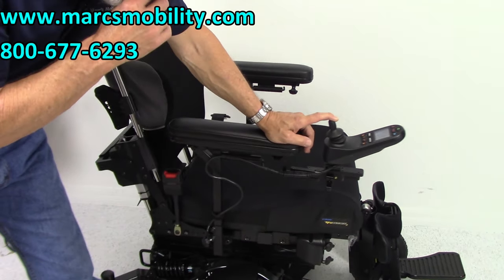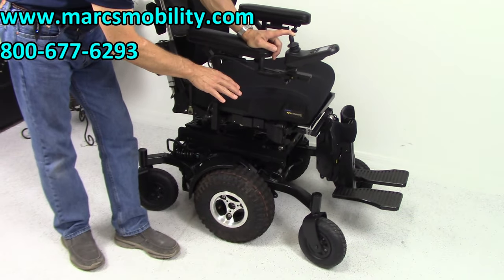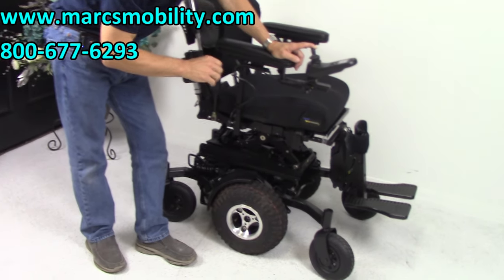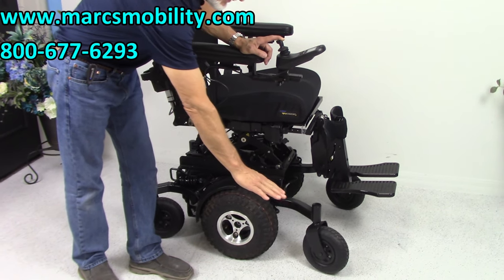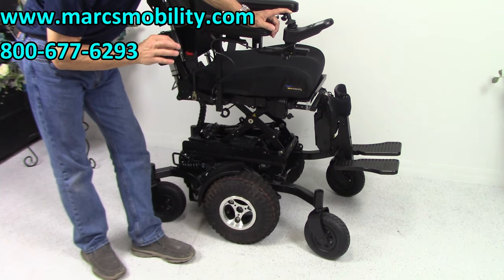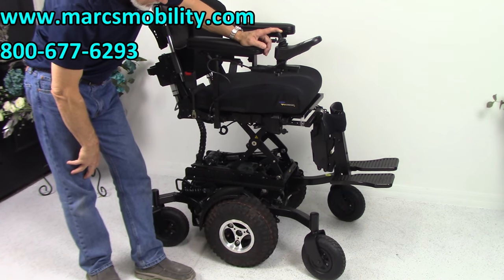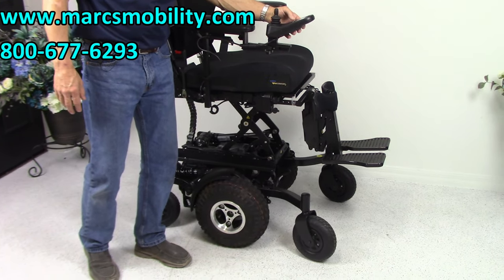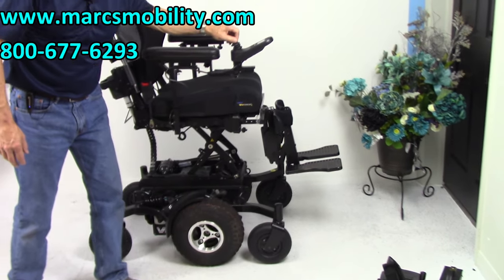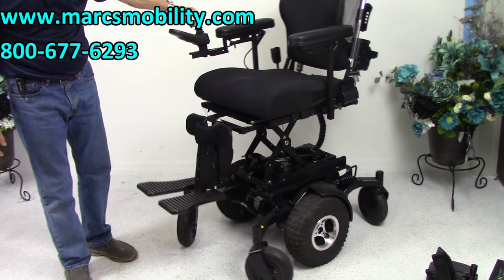The seat starts at roughly 22 inches when it's down, and you get 12 inches of lift — so 22 plus 12, you'll be at 34 inches. This is a slow-rising seat, so give it a few seconds to reach the top. The nice thing about this chair is you can still drive it with the seat raised all the way up.